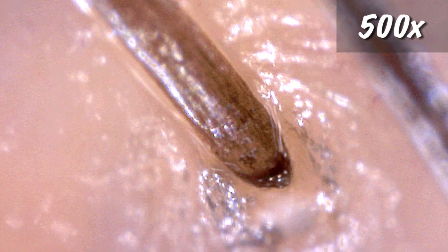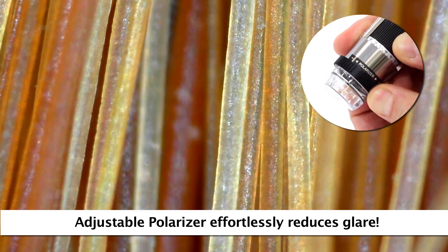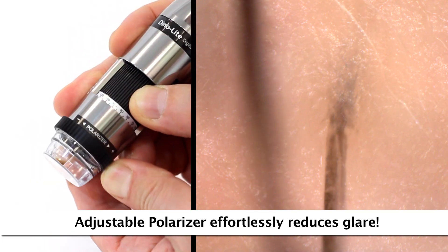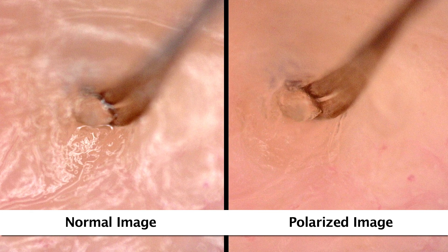Here are some examples of the standard working distance and corresponding magnification with typical results. Some Dynolite scopes have a built-on adjustable polarizer that helps to provide more clarity and different results in imaging with polarized light. The polarizer is fully adjustable and can go from non-polarized to fully polarized and anywhere in between.